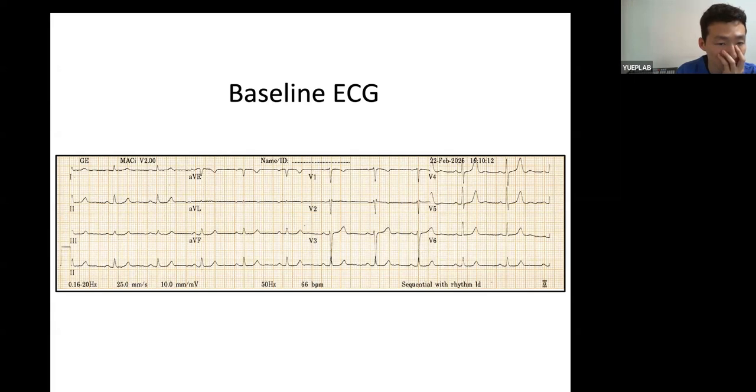What does it show? Transition, still a little bit late. What does that mean? The patient has right ventricle overload, right? That's what that typically means, and that's the change in repolarization you see. Okay. And then the chest X-ray.